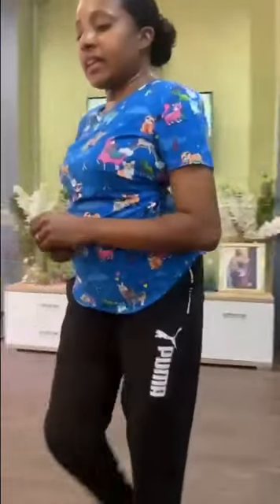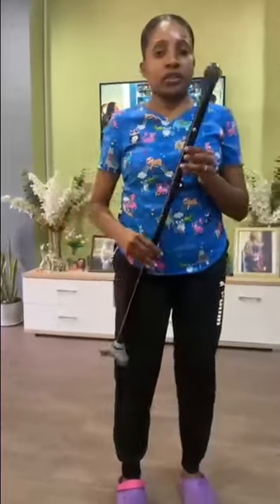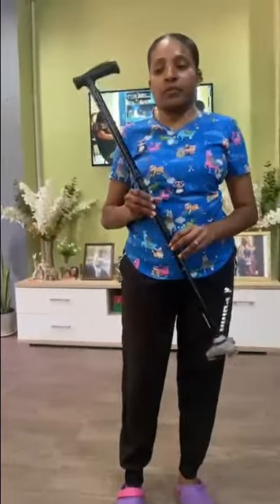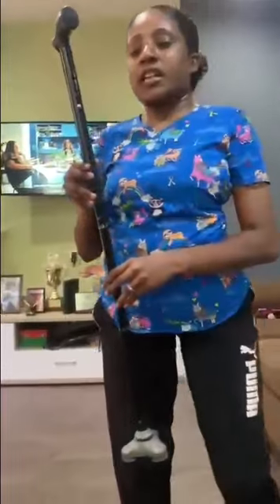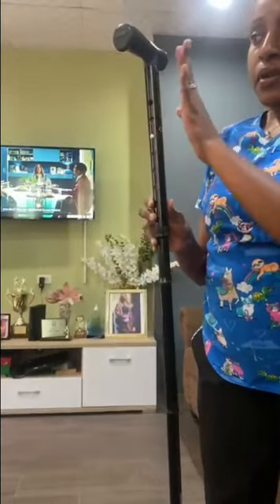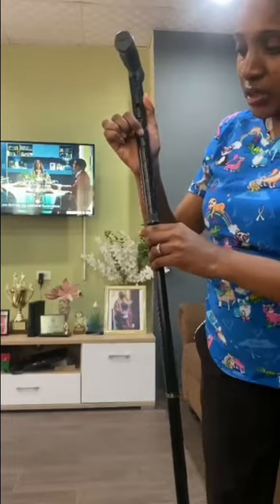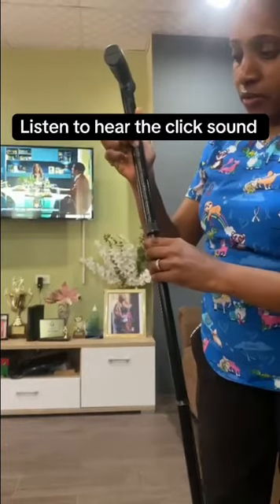So in that case, what we can do is use, you guessed it, a cane, right? When using a cane, it's important to know how to properly use it. What you'll need to do is adjust the cane to the patient's hip. So it should be at the patient's hip level, and you can easily adjust it with this little button right here.